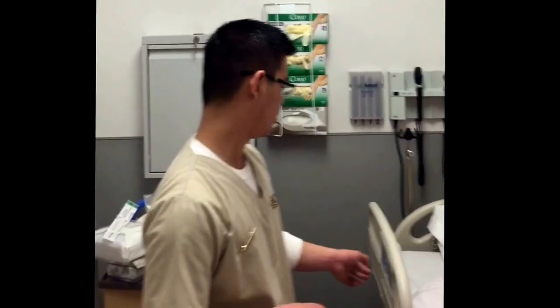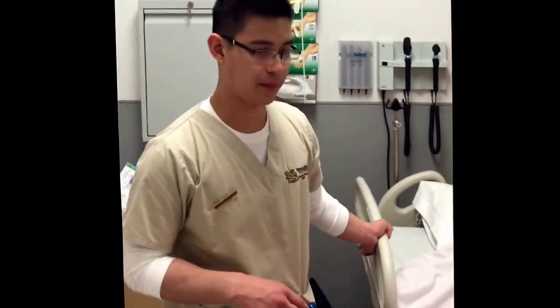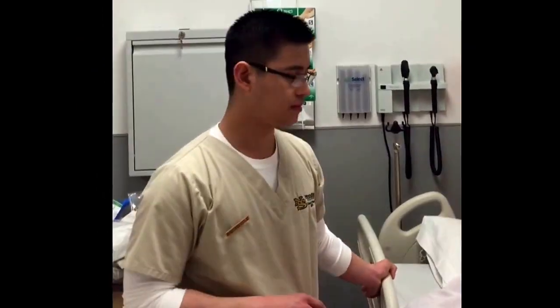And after you put the catheter on your patient, just make sure that you document everything, any abnormal findings or any significant information on the urine and catheter. Okay. Make sure you record your patient's reaction, and make sure that you put the bed down after the procedure.